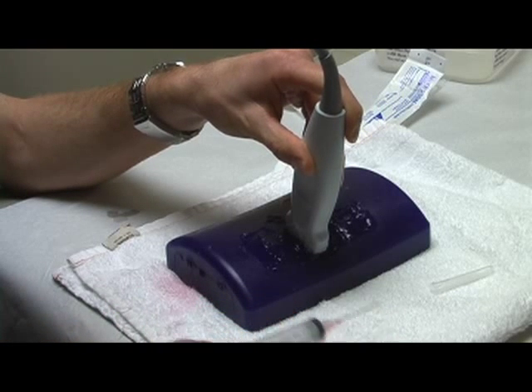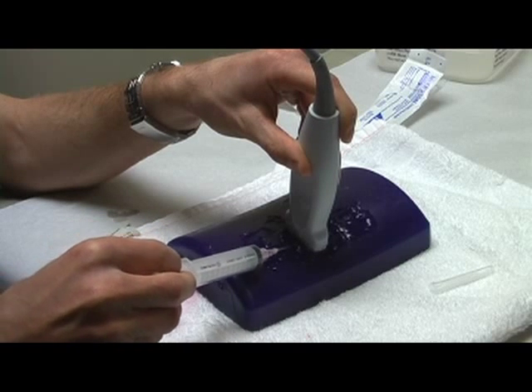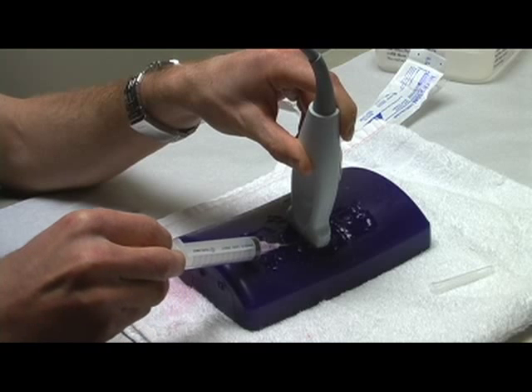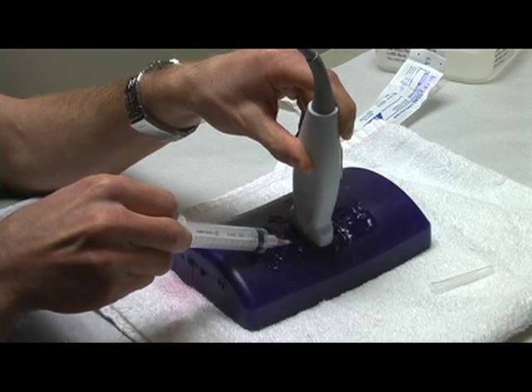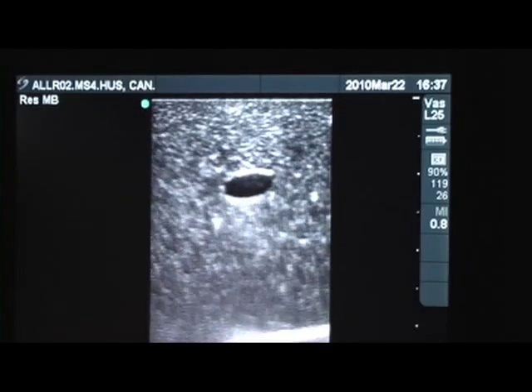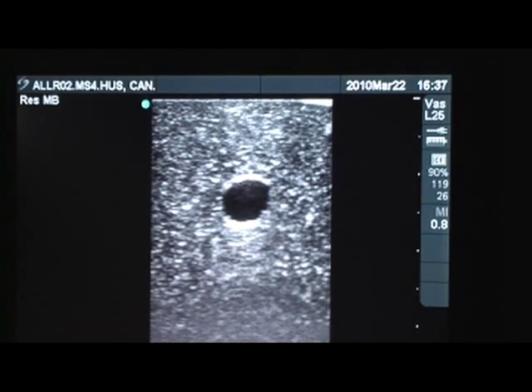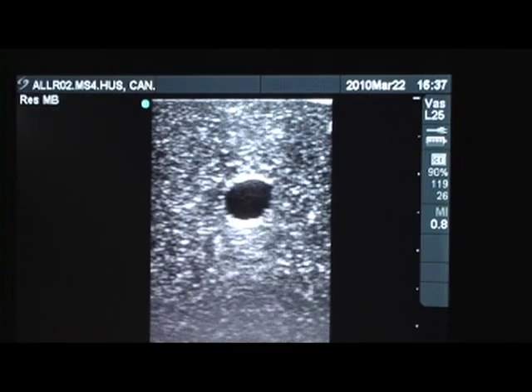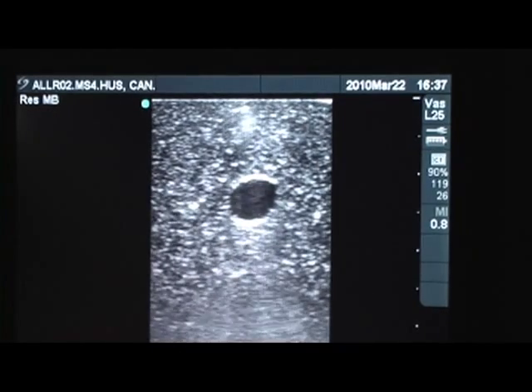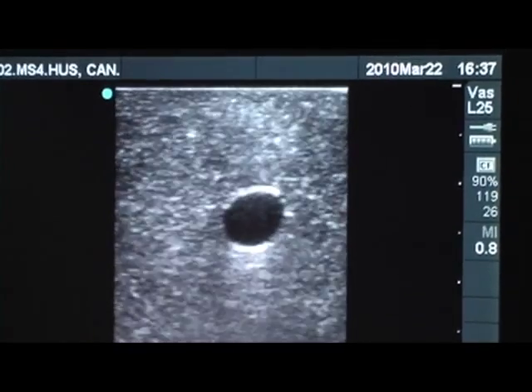However, the student is still able to get a feel for what it's like to visualize a needle entering the vessel. So again, the student can see the compressibility on ultrasound, but a glaring difference once again is the absence of a second vessel. Again, we have the North Star appearing in the near field, which the student can follow.